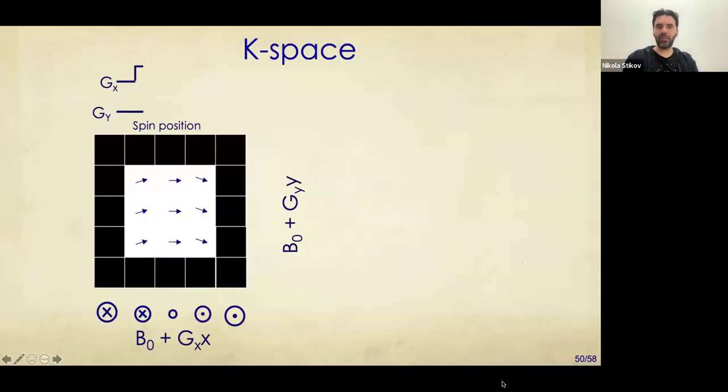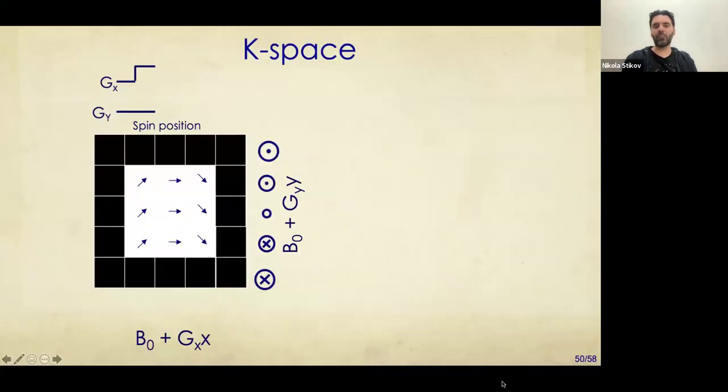Okay, so X gradient turned on, they have moved, Y gradient, and now I end up with a pattern that is diagonal, okay? So now I have variability that is in this direction. And now I have another way of exploring what is the structure inside this black box.